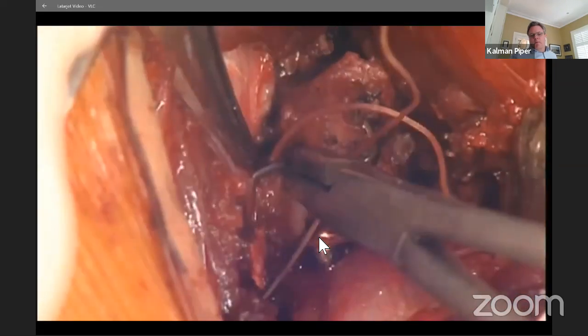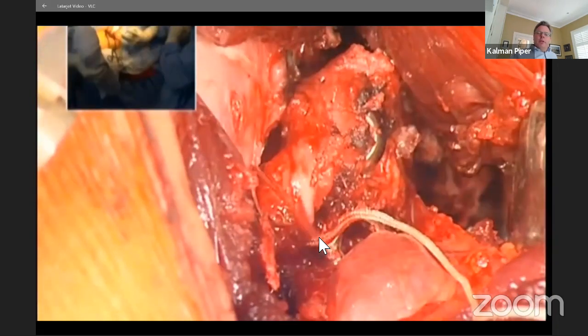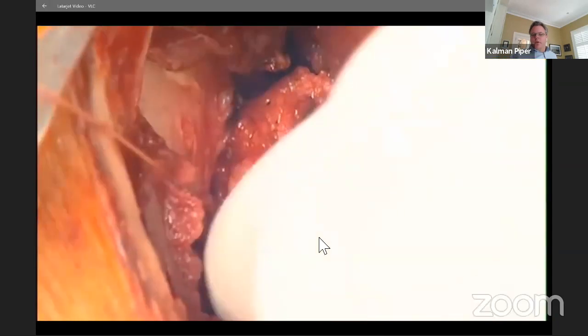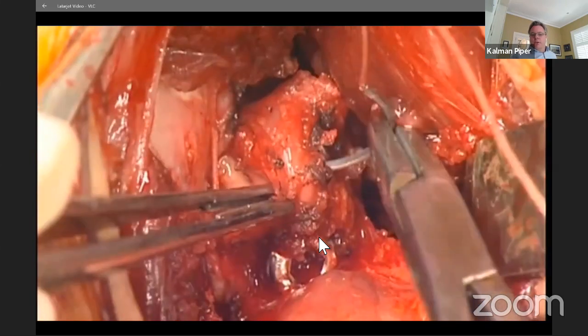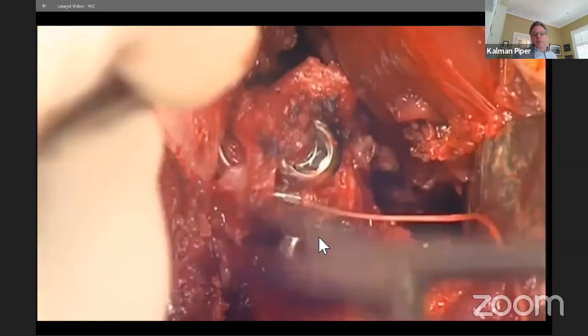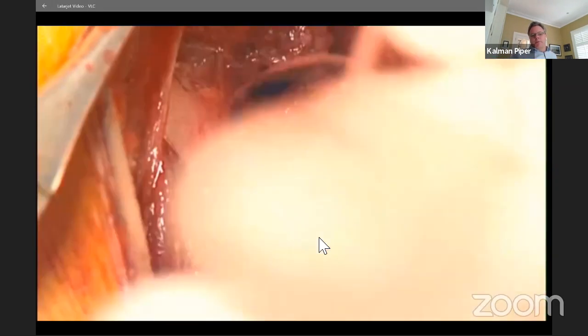So use one Vicryl to repair the stump of the CA ligament. Obviously, you need to remove the Fukuda. Once I pass the sutures through the stump of the CA ligament, remove the Fukuda, and then pass it through the capsule. You only ever stitch a Fukuda in the shoulder once.